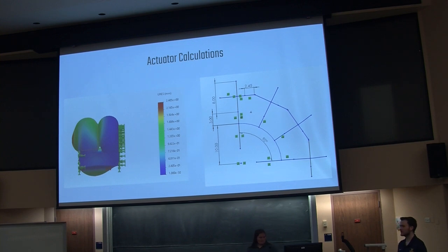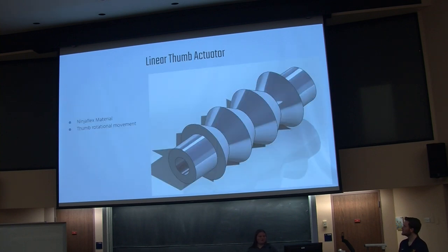And the image on the right is the expected behavior if the radial displacement goes through as we expect. This is our linear thumb actuator. As you know, the thumb has more degrees of movement compared to normal fingers, so this should act as an actuator to help reach that secondary degree of freedom.